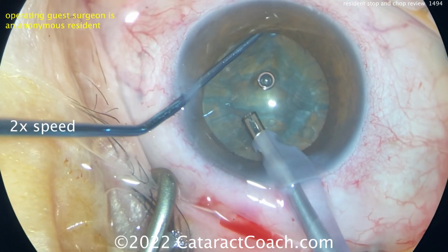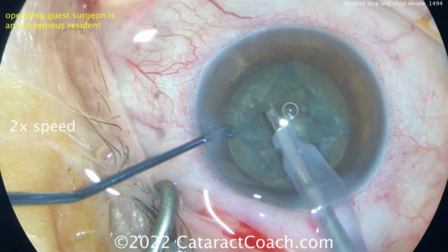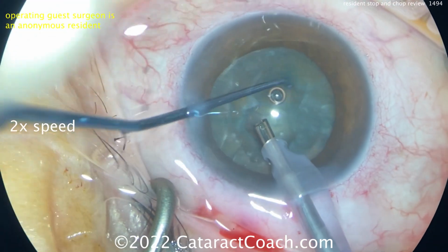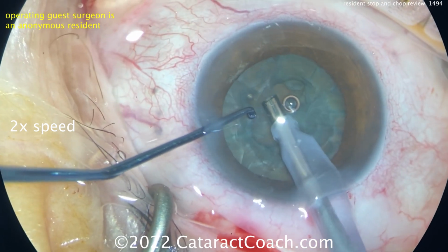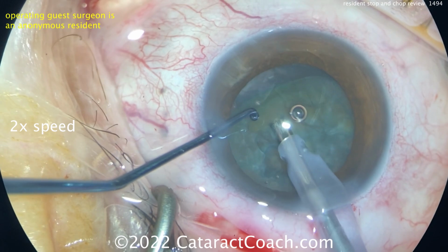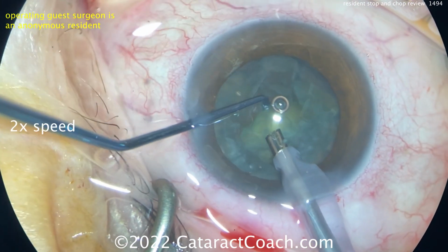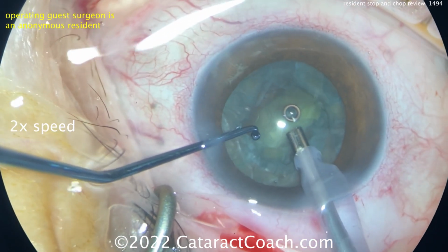And now, the key with the softer lens is really getting that piece up without buzzing through it. You don't want to go through the piece and nail the posterior capsule. So I like this rotational technique to find an area that has a little bit more substance so they can vacuum into it. And it's a little bit more challenging here. So here's where I'd get that chopper around it. That's what I'd do. Get the chopper around that lens equator and bring up that piece. That makes it a lot easier.